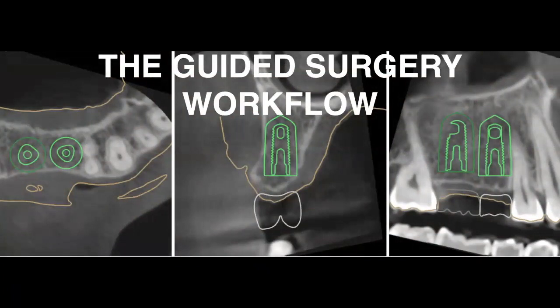And there are 2 ways that you can do this. Once you get your CBCT, way number 1, you can use your own dental lab. You've got to make sure that the dental lab you're working with actually has the technology to do this digital workflow for you. The one that I recommend and the one that I use is Oral Arts Dental Laboratories in Alabama. That's the lab I used to fabricate this guide that I'm going to share with you today. But at the same time, I'm going to share with you a way that you can do it in your own office yourself.